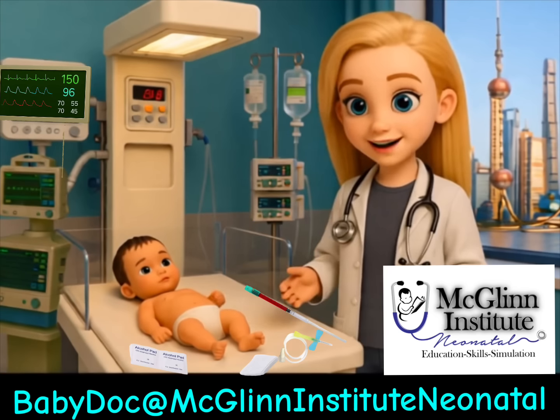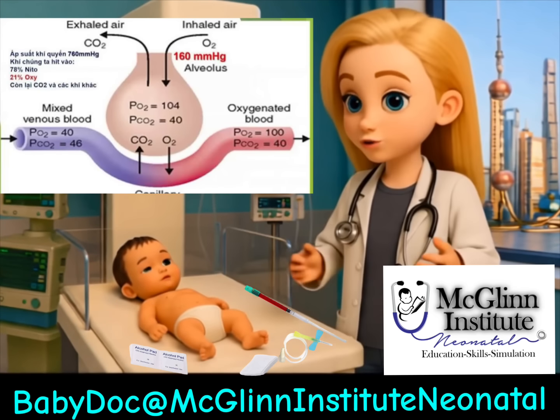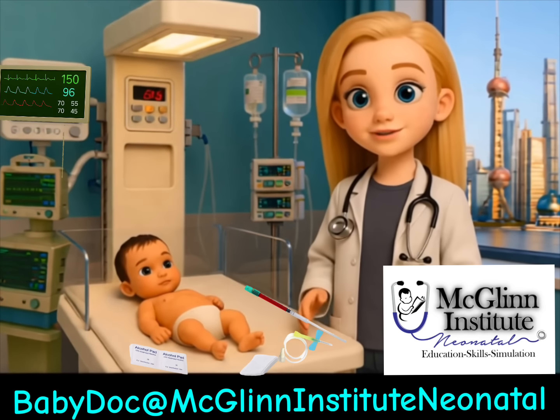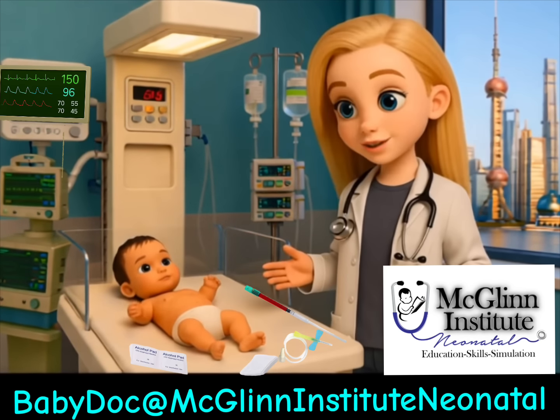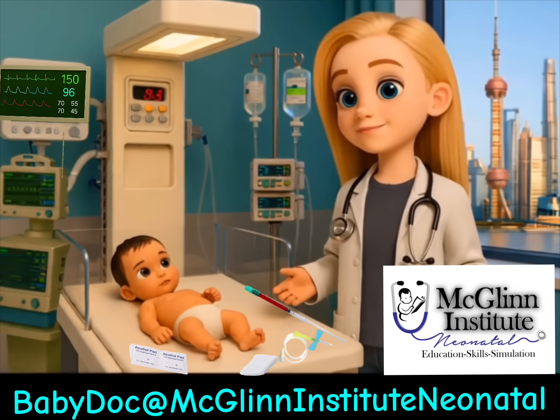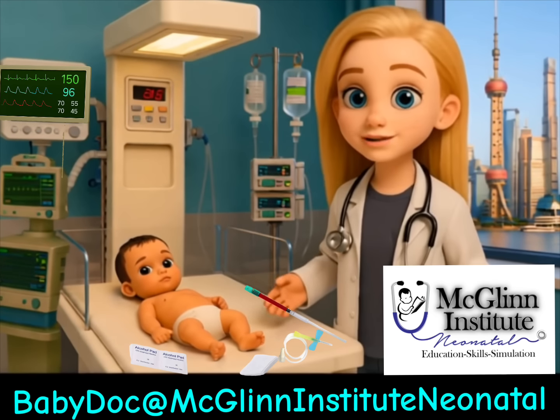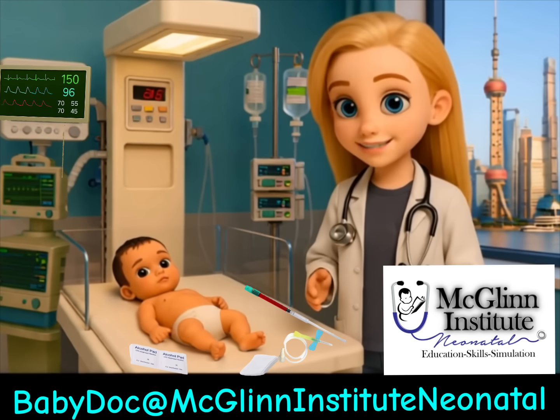The final step is to assess oxygenation. PaO2 measures the partial pressure of oxygen in the blood. Normal arterial PaO2 is 50 to 80 millimeters of mercury. This step is only reliable with an arterial blood gas sample. A low value, hypoxemia, indicates an oxygenation problem. Some causes include respiratory disease, congenital heart disease, pneumothorax, and aspiration.